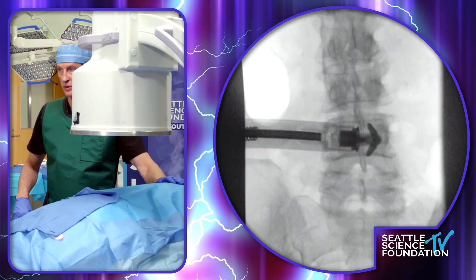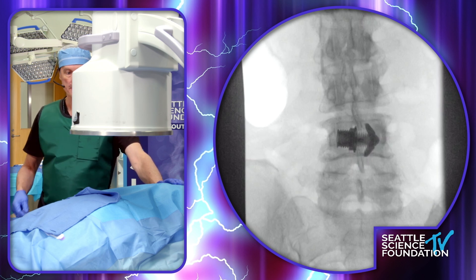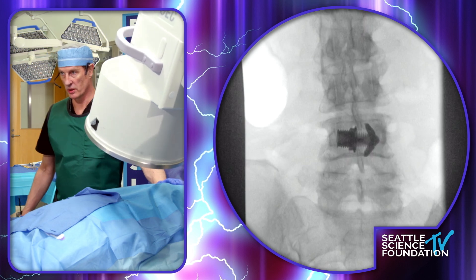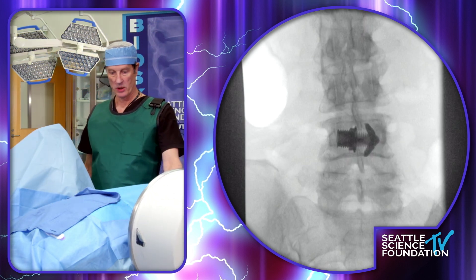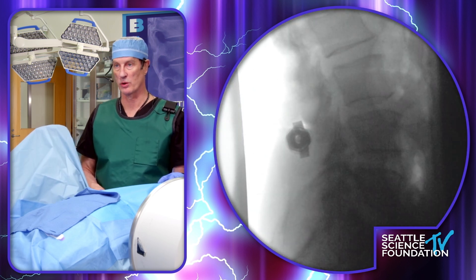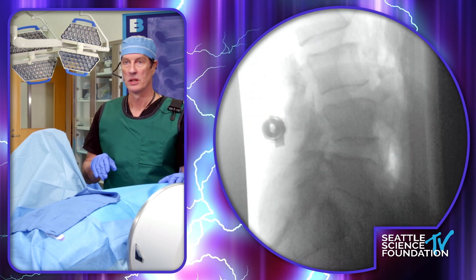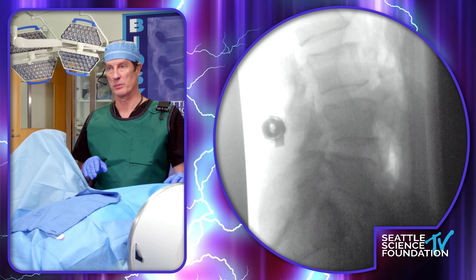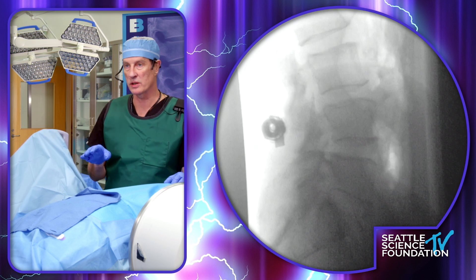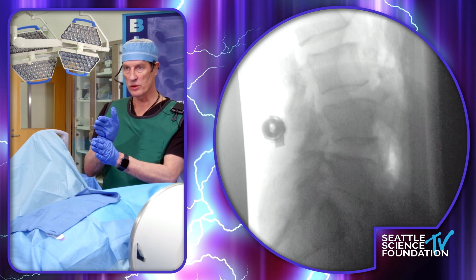Let's take a final shot there. Fantastic — this is really good. So that's very nice L3-4 placement of this, and that's about all it takes. This is not a long procedure. This is an interspinous fusion spacer — it has a graft window in the center of it. Ideally it's placed just posterior to the inferior articular process, and you can see the spinous processes, which the wings grab hold of. I mentioned the comment about subsidence earlier: all interspinous implants will have some degree of subsidence. This has a window in the top and the bottom — you fill that window with graft and the spinous processes will subside onto the implant.